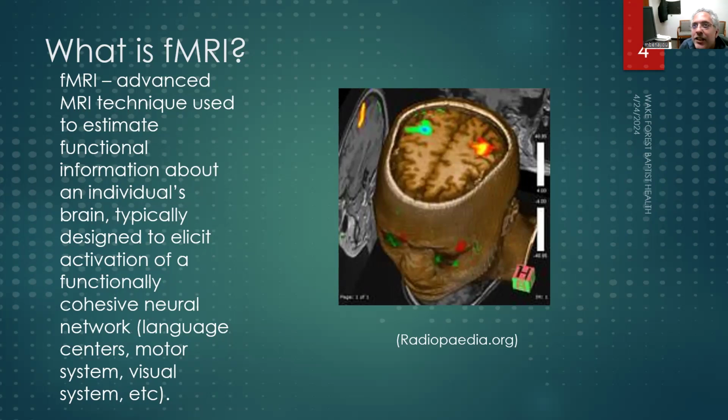And I think the applications of fMRI in research largely surpass those limited aspects. But for reimbursement purposes in a clinical setting, that's pretty much the scenario that you'll get. And when we get to our clinical case, that will be the indication for that person's fMRI.